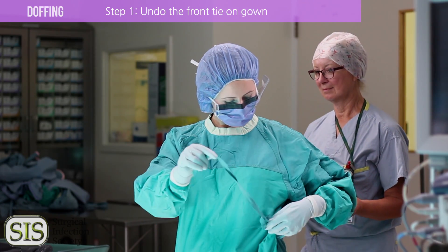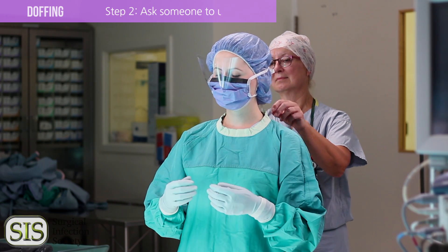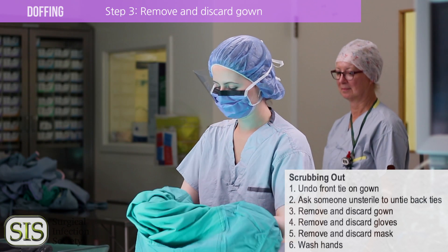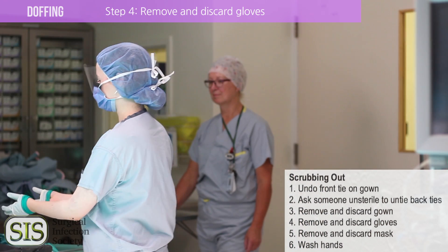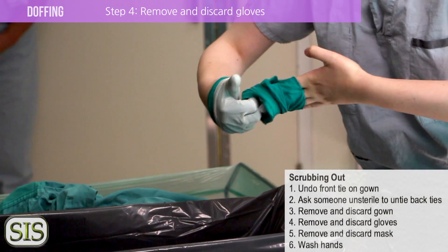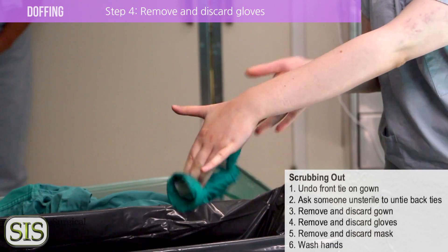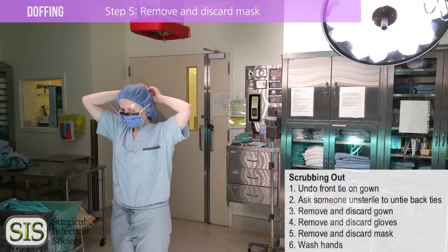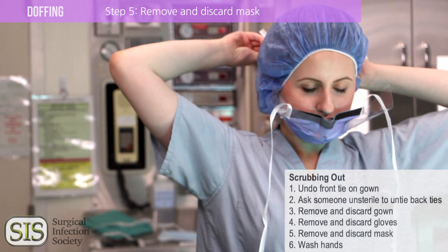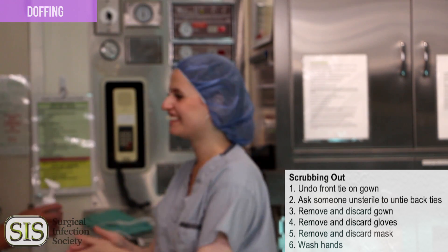After your work is done in the OR, you'll need to scrub out. Undo the front tie on your gown and ask for assistance to undo the ties at your back. Remove and discard the gown. Remove and discard the gloves — make sure to remove them so your bare hands do not contact the dirty outsides of the gloves. You can do this by hooking underneath the rolled glove. Remove and discard the mask; if the operation is still in progress, leave your mask on until you exit the OR. Last but not least, wash your hands. You're all done.